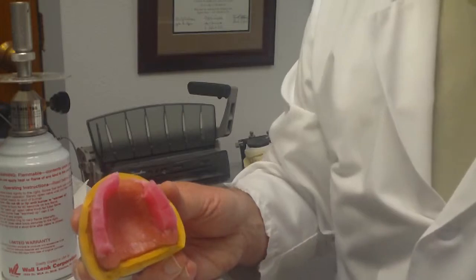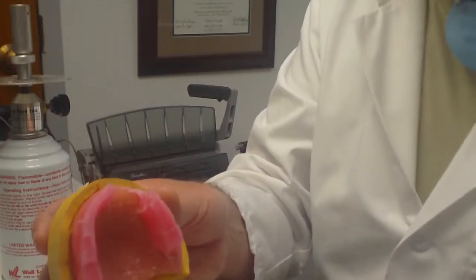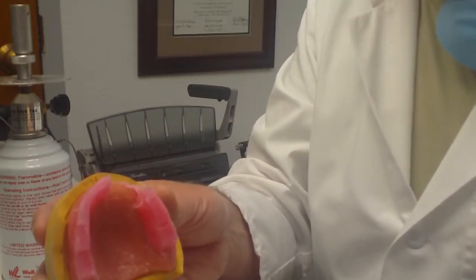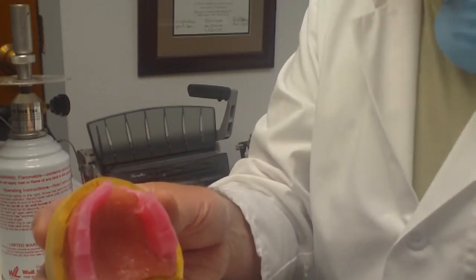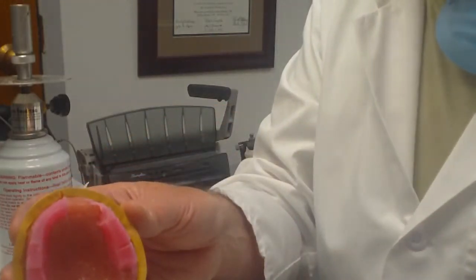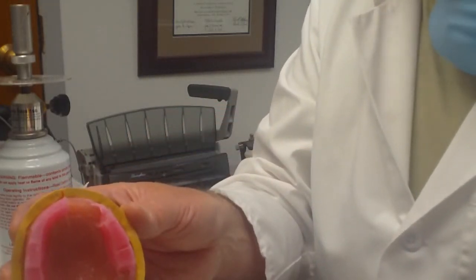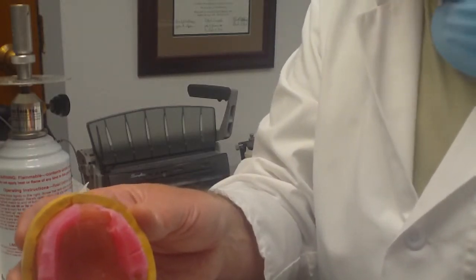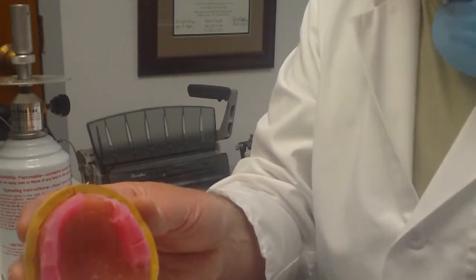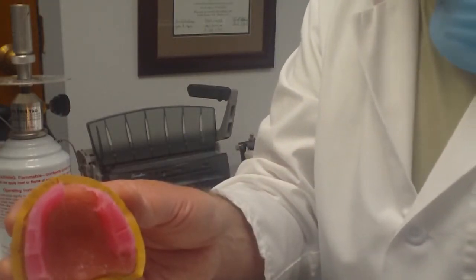So at this point, a little trick I learned some time ago about arranging teeth is to make a little wax root on the denture tooth, and then use that to help set the teeth. Lots of times you'll just see people make a little block section out of the occlusion rim and set the denture tooth back into a sea of wax, and I find that difficult to manage later on, particularly when you're trying to finally contour your wax-up for the trial denture or wax try-in. And so this is a method of accomplishing that.